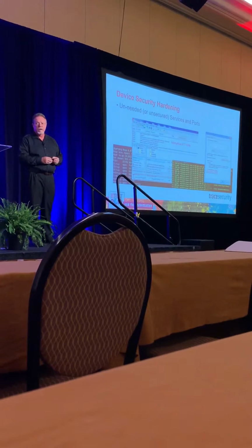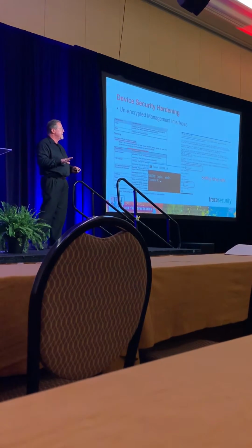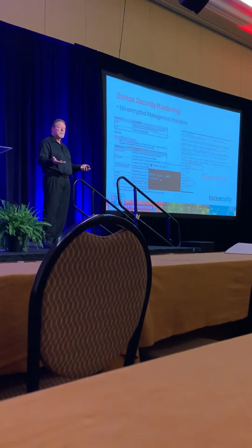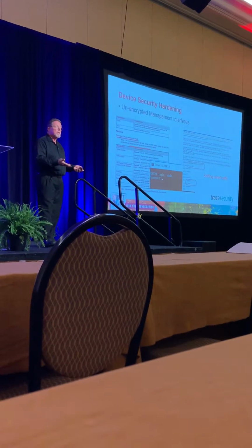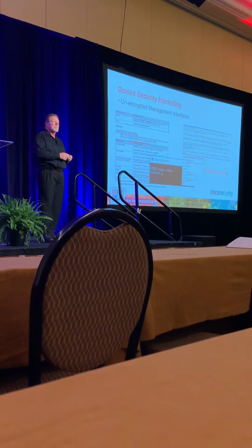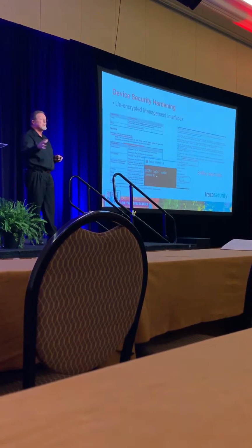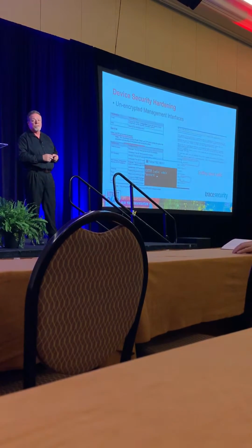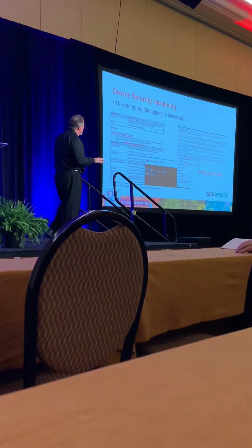turning those services off. Another example of a service that may or may not be needed is management interfaces. Now, management interfaces may be web-based, they may be logins, they could be HTTP, which is unencrypted, or they may actually be secure. But the point is those management interfaces may or may not be needed. And again, as part of the hygiene, there should be some type of checklist in your organization where you determine what services need to be turned on or off, particularly if the service is an unencrypted protocol.